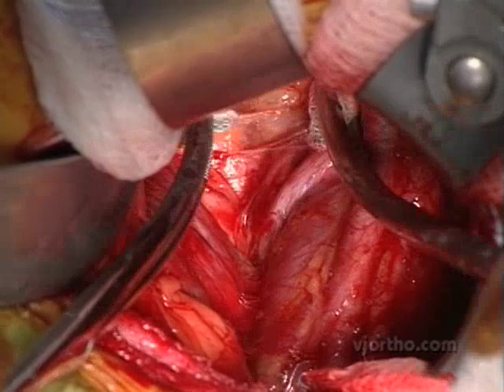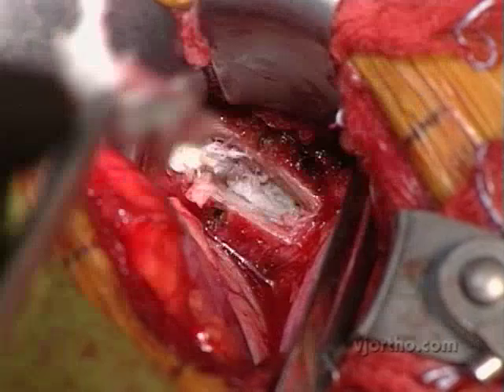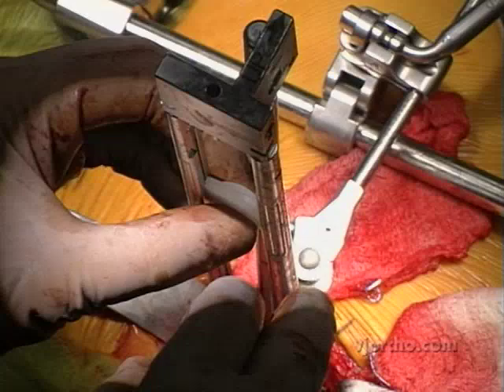We need to clean out the disc completely right to the vertebral end plates. I'm using a pituitary rongeur now to remove this disc, and as you can see, it's quite degenerative. It's also very important to try to make sure you get back to the posterior annulus so that you can position the prosthesis where you want in the front back.